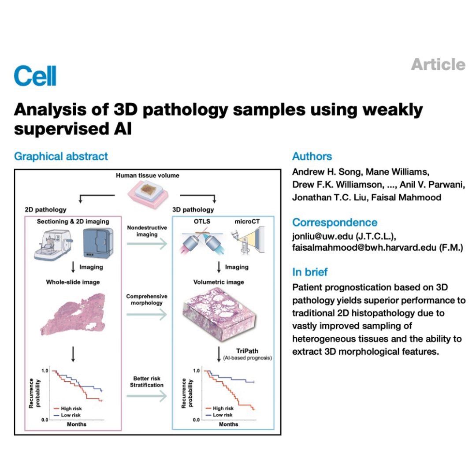Exactly. It assigns an attribution score to every single one of those small 3D patches we talked about earlier. A high positive score means that patch strongly pushed the prediction towards unfavorable prognosis or recurrence likely. A negative score means the patch indicated a more favorable outcome. And when they looked at the patches the AI highlighted as bad news, what did they see?